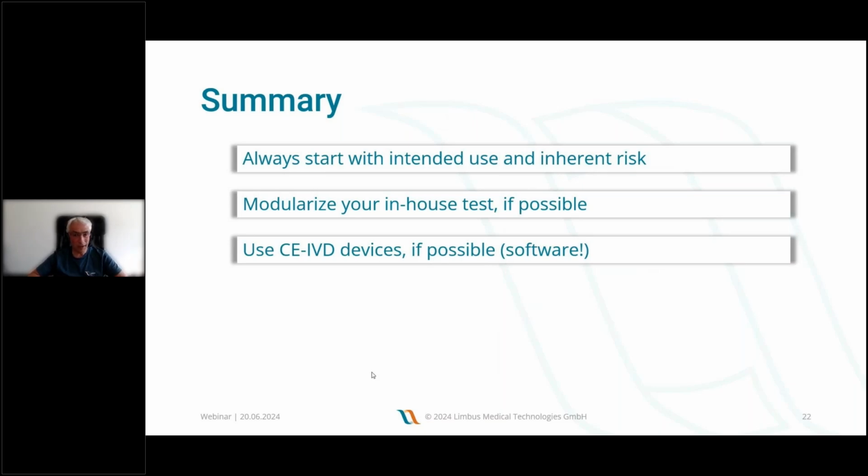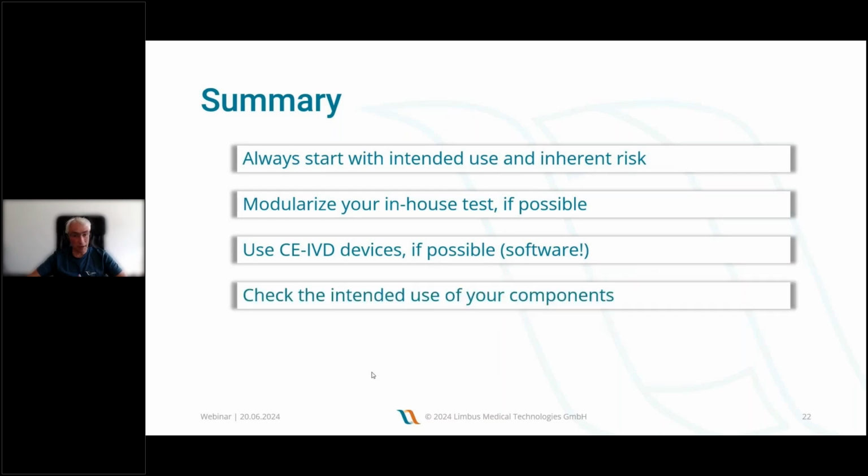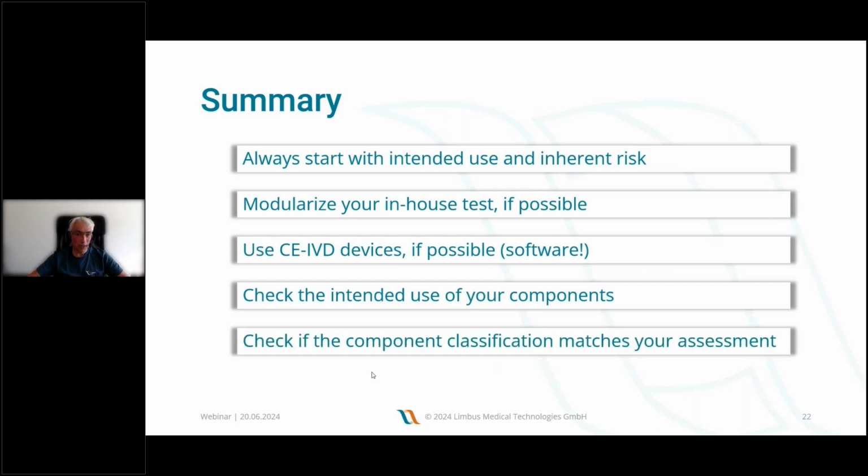I can only recommend that because we've already done all the work for that. And if you're not sure about the CE labeling, check the intended use of your components. Is the component really meant for what you're using it for? If this does not match, you take over the responsibility of the manufacturer, and check if the component classification matches your own assessment. In the end, you're responsible for the entire in-house test, and it's up to you. It's your risk assessment. And you have to make sure that all your components match your own requirements.